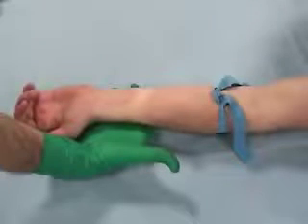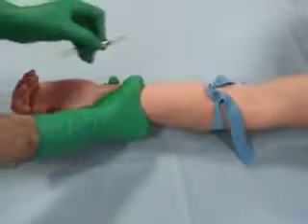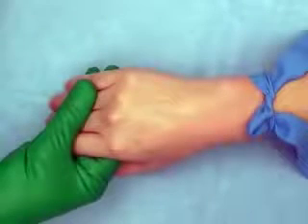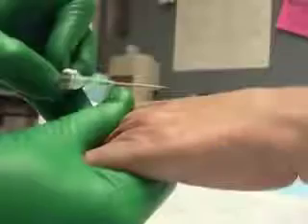If a forearm vein is selected, use your non-dominant hand to encircle the patient's arm. Place your thumb on the skin distal to the venipuncture site and pull down. Regardless of the venipuncture site, always maintain a firm grip on the patient's hand throughout the procedure.